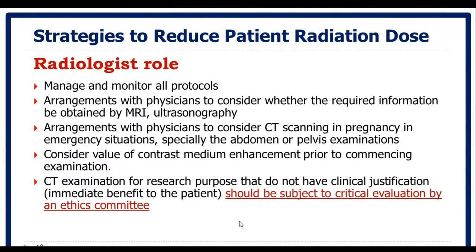And also CT exams for research purposes, we need to be careful about this point. Any given CT examination should have an immediate benefit to the patient, and don't think about having extra CT cuts for the purpose of research, and any research purposes should be subject to the evaluation of the ethics committee.